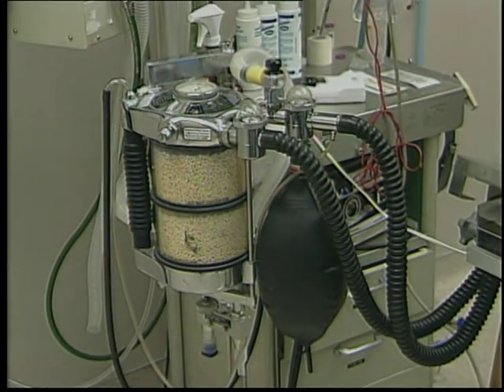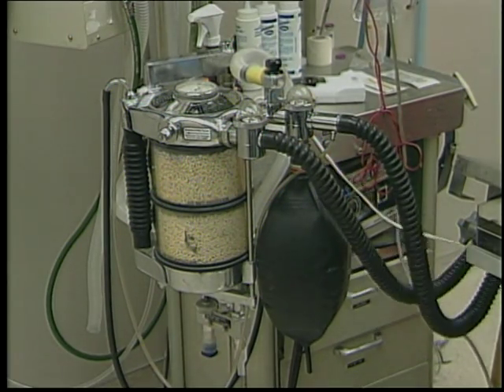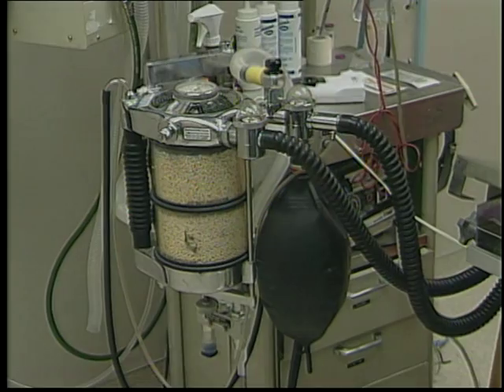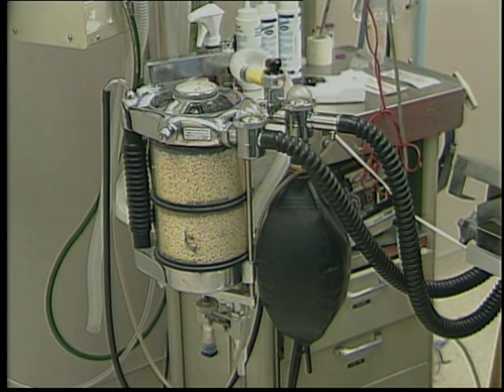Monitoring respirations involves making sure the patient is taking regular breaths. This can be done by watching the movement of the chest or observing the rebreathing bag on the anesthetic machine. More will be discussed on monitoring techniques and instruments in upcoming programs.